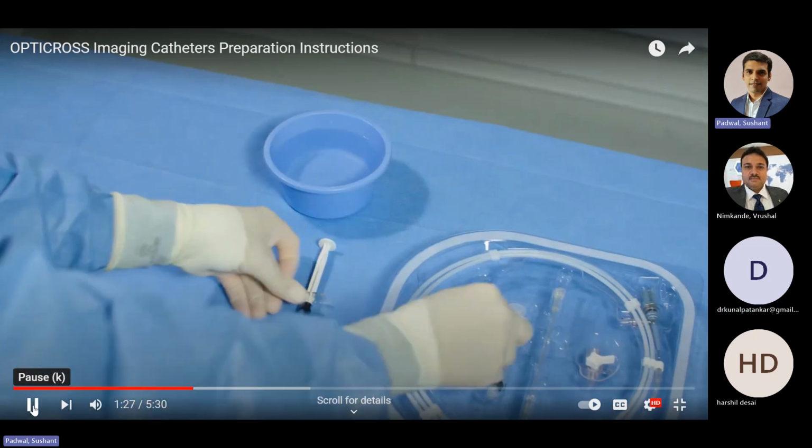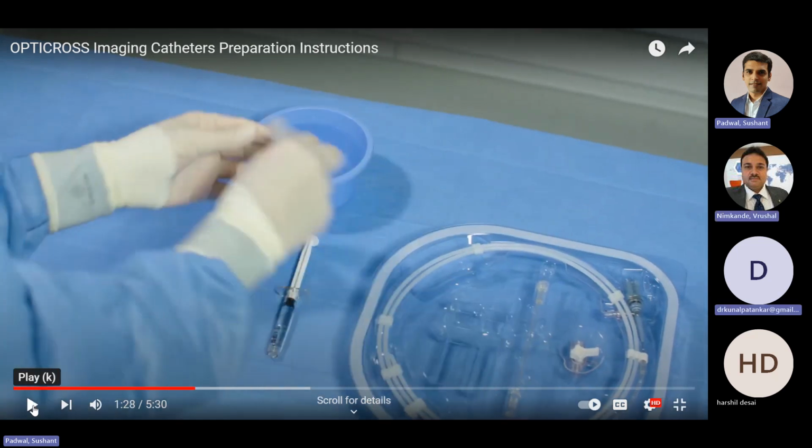All air is expelled. The reason for doing it 2-3 times is that the new syringes have some kind of lubrication inside. The wall of the syringe, if you fill it up for the first time, the entire internal wall of the syringe will have micro bubbles stuck on it.